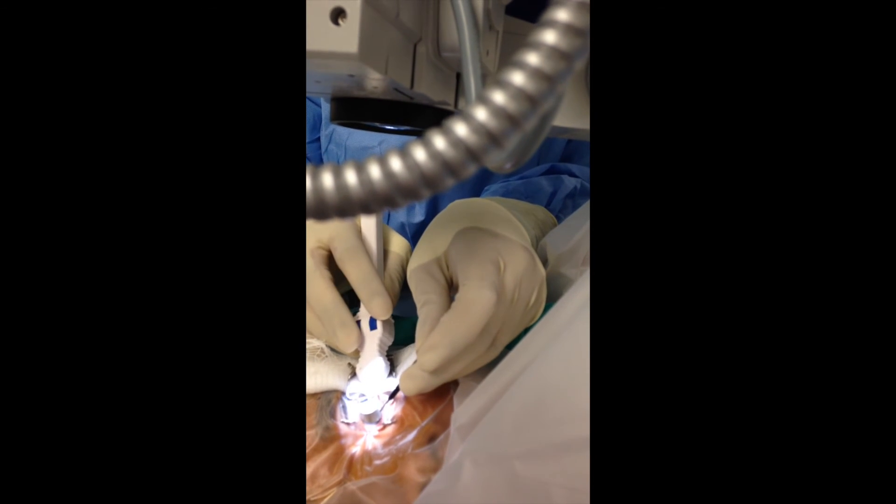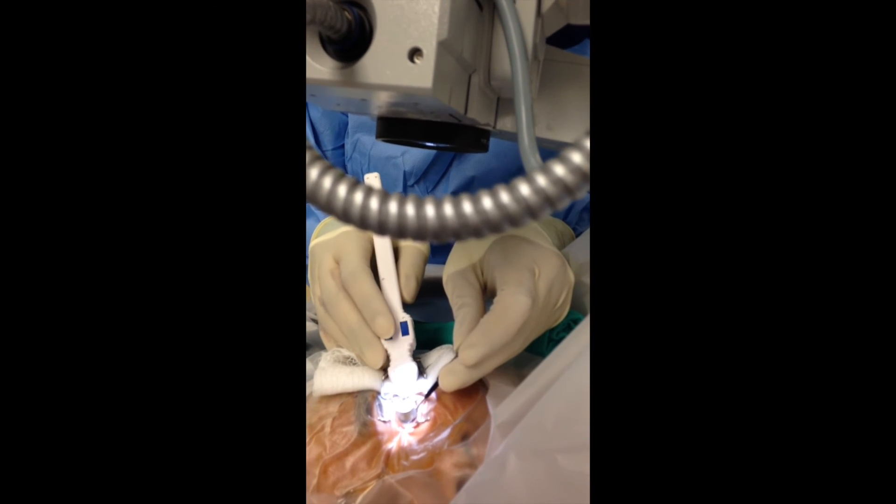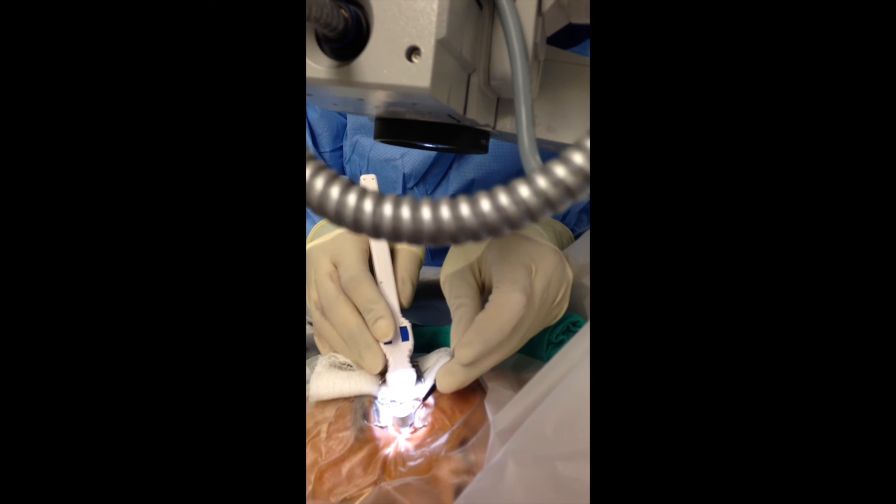Once completed, the instrument is turned so that this approach can be done to the other side for up to 360 degrees of treatment.